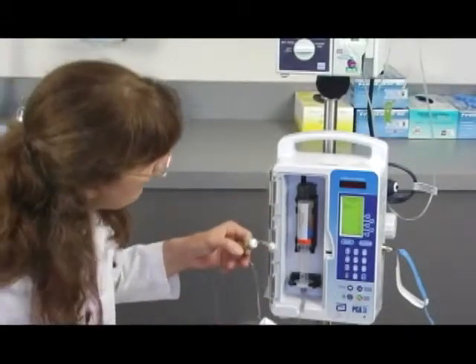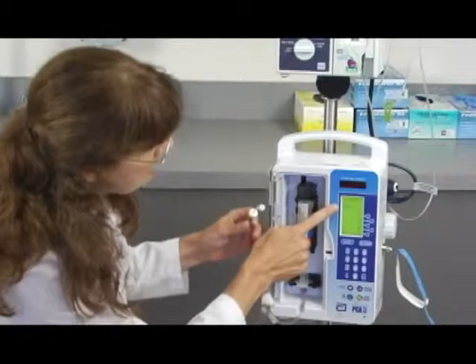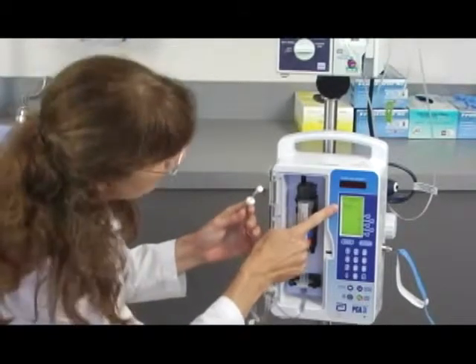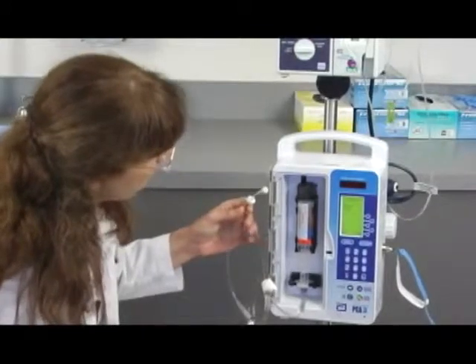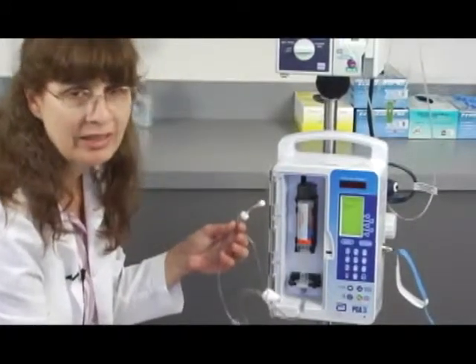And there is some medication coming out. Once you let go of that button, it asks: am I done? It says purge complete, and the answer is yes. I will press that. It now gives me permission to reconnect the patient.